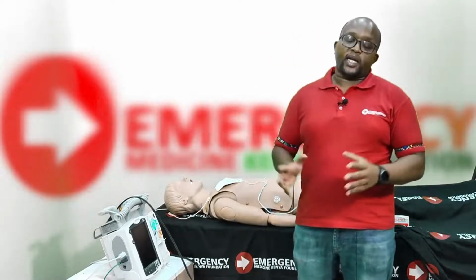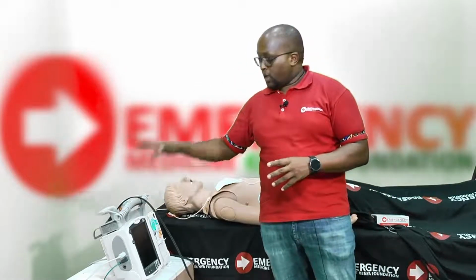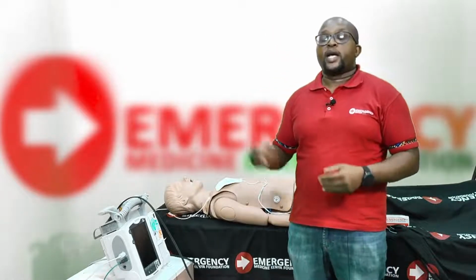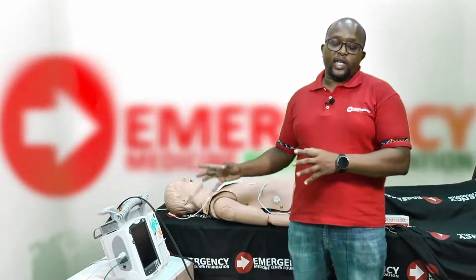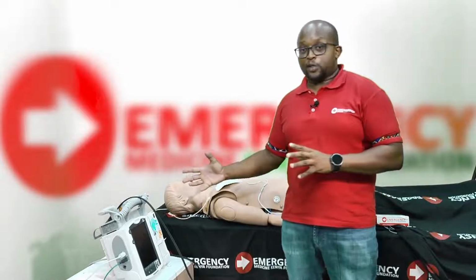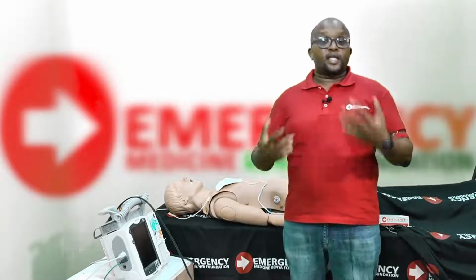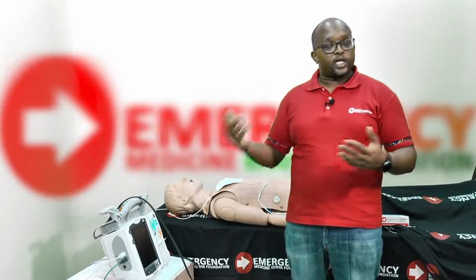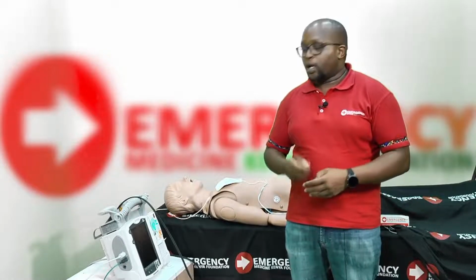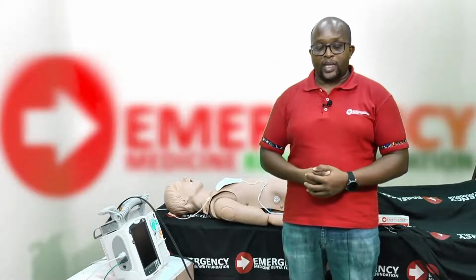So before anything else, you need to confirm if the defibrillator that you have in your hospital or facility has a pacing function, as this does not come standard in most defibrillators. So always confirm that your defibrillator has a pacing function to allow you to pace a patient. Now, the procedure I'm going to describe is available in the emergency care algorithms and also in the Casualty app, which you can download freely from the Play Store, and it will take you through the step-by-step guide on how to pace a patient.